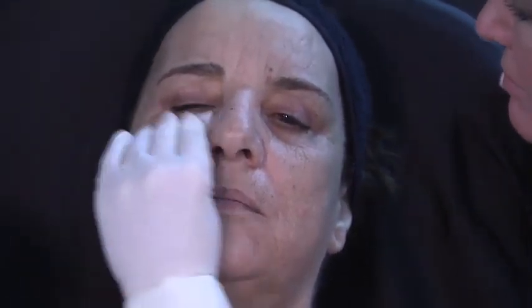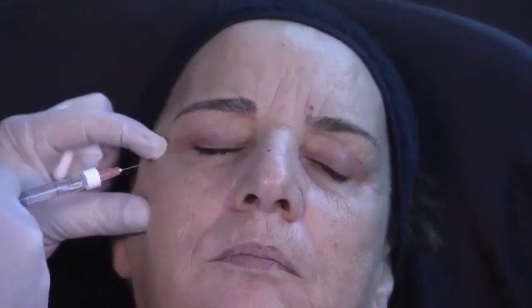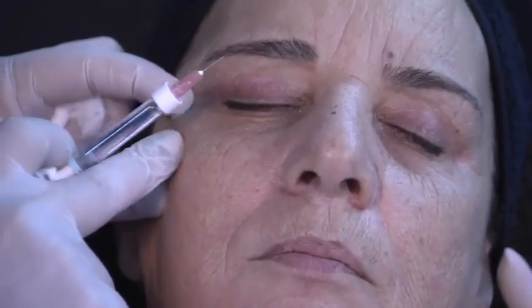and that's the beauty of these products. They give you the leeway and flexibility to personalize even the technique that you want. There are many different ways to achieve good results. My technique is not the only one. I'm sure all of you have very good results with your patients. I'm just sharing my experience with you. Pick up what you think is interesting and keep doing what you think is better than what I do. This is just a way to explain the behavior of the products in our patients.